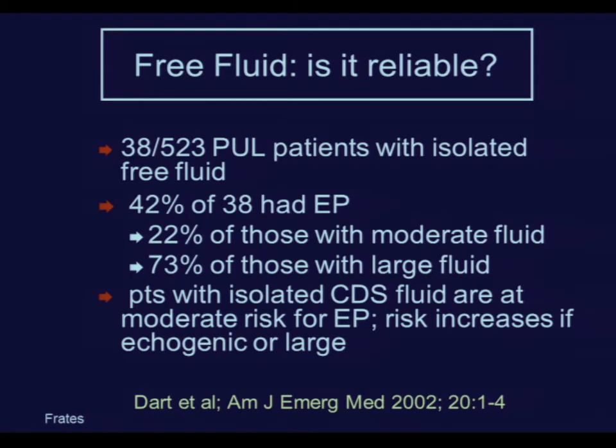So patients who have isolated cul-de-sac fluid with no adnexal mass identified are at moderate risk for an ectopic pregnancy, and the risk increases if the fluid is echogenic or if the amount of fluid is large.